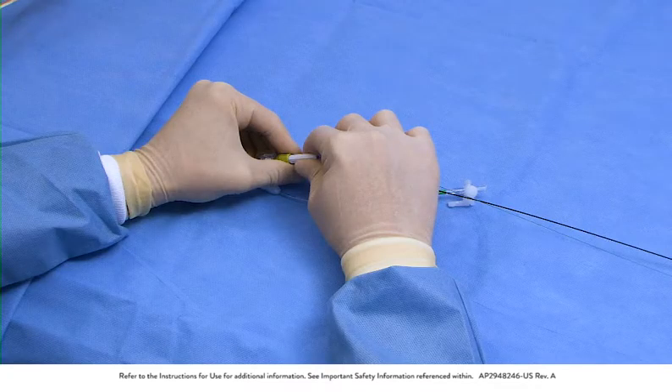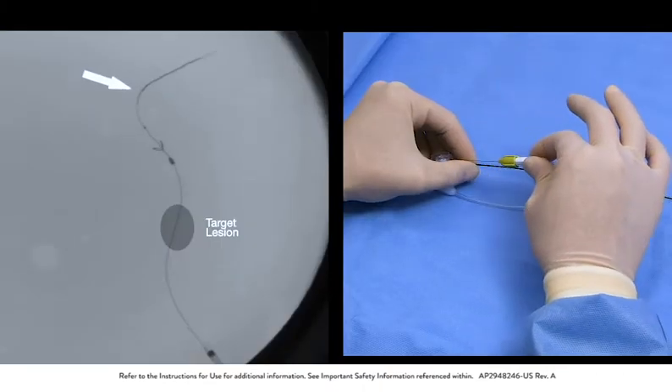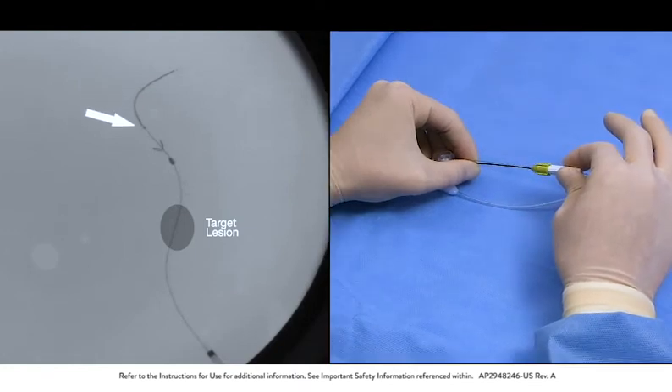Grip the retrieval catheter shaft close to the rotating hemostatic valve to hold the catheter position steady. Use the torque device provided. Grip and retract the bare wire until the proximal radiopaque section of the wire meets the distal end of the filtration element.